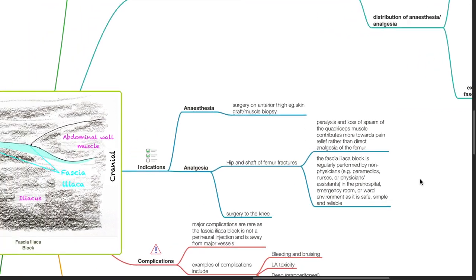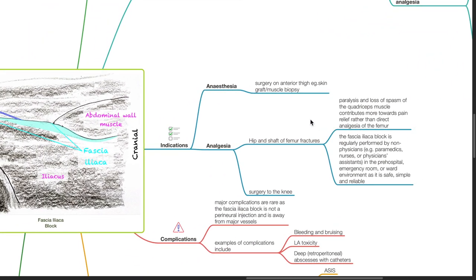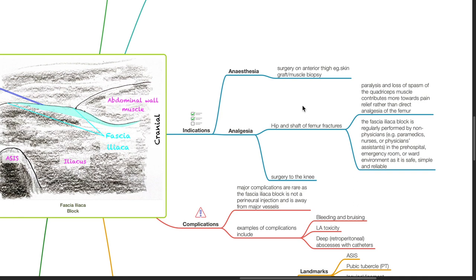Indications for fascia iliaca block. For anesthesia for surgery on the anterior thigh, for example, skin graft or muscle biopsy. Analgesia for hip and shaft of femur fractures and surgery to the knee. For femur fractures, paralysis and loss of spasm of the quadriceps muscle contributes more towards pain relief rather than direct analgesia of the femur. The fascia iliaca block is regularly performed by non-physicians such as paramedics, nurses, or physician assistants in the pre-hospital, emergency room, or ward environment, as it is safe, simple, and reliable.